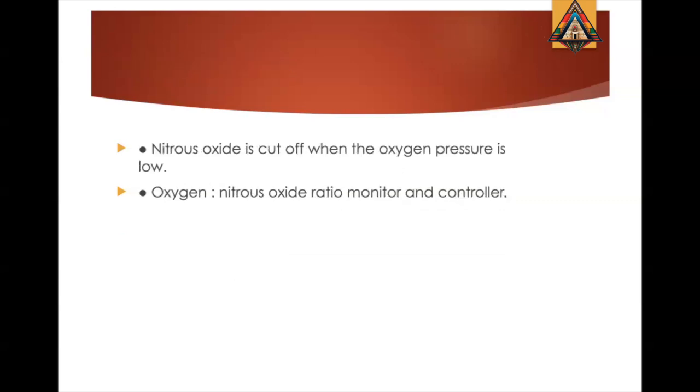Another safety feature is that nitrous and oxygen are connected to each other so that you cannot give nitrous oxide alone without oxygen. So whenever you raise nitrous, oxygen rises with it. And oxygen nitrous ratio monitor and controller are also safety features within the anesthesia machine.